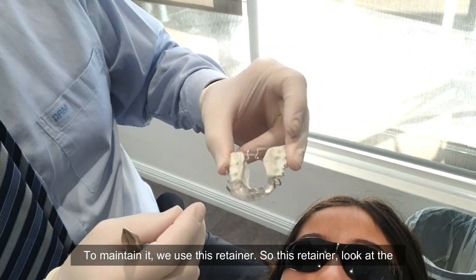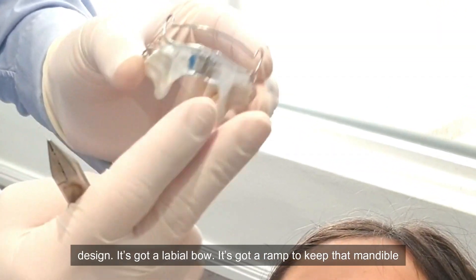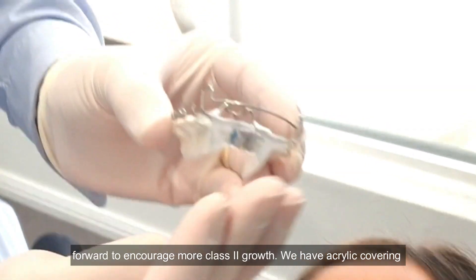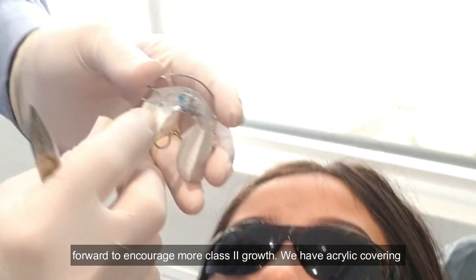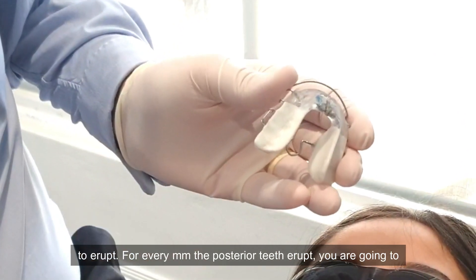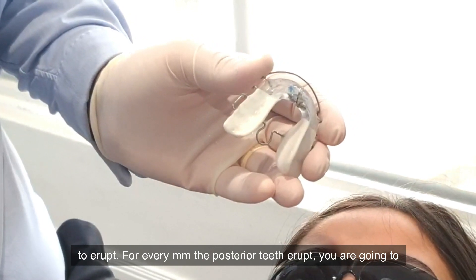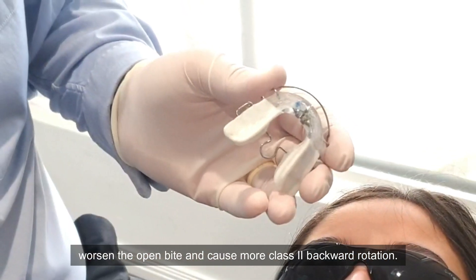Look at the design — it's got a labial bow, and it's got a ramp to keep that mandible forward to encourage more class two growth. We have acrylic covering the posterior teeth because I don't want the posterior teeth to erupt. For every millimeter the posterior teeth erupt, you're going to worsen the open bite and cause more class two backward rotation.